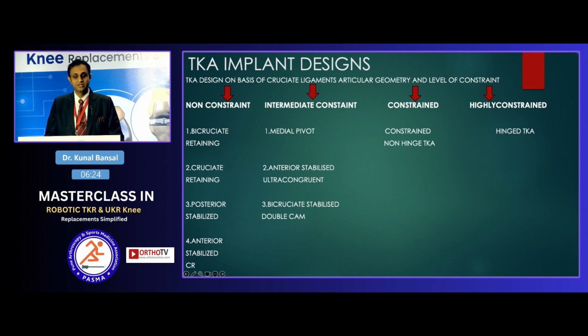In the constrained or semi-constrained, you have the constrained non-hinge or the LCCK kind of implants. In the highly constrained, you have the hinged implants in all their varieties.